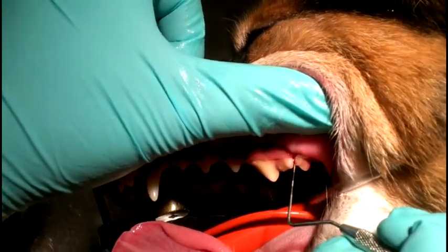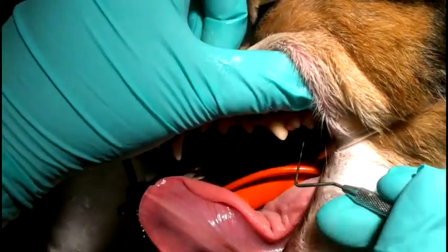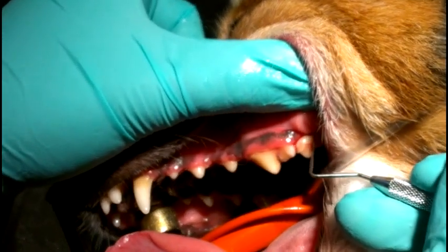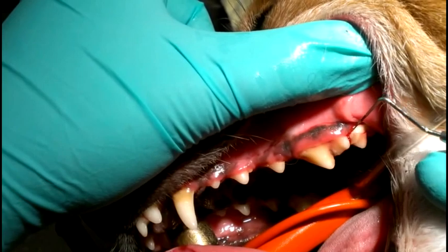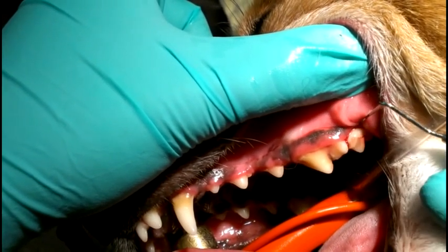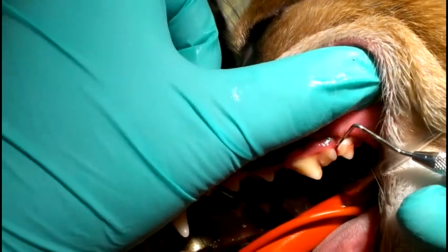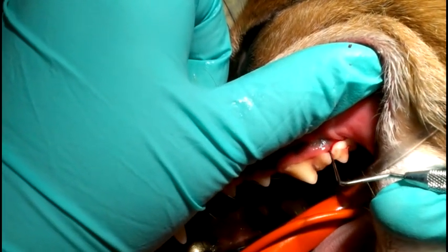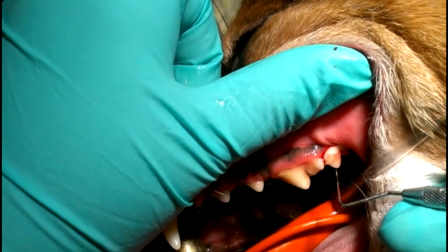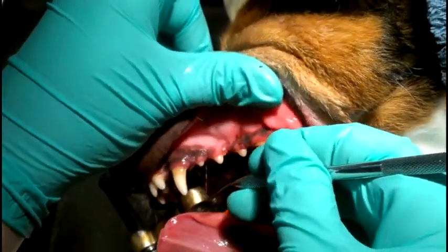Okay, we just flipped Mabel over to start cleaning her teeth on the upper left side. And what I noticed when I probed is this first upper molar has a lot of gingival recession. You can see how the probe kind of goes up in there between the roots. So what we're going to do next is take an x-ray of that tooth to see if it's abscessed or loose or if it's a tooth that she may need to have extracted today. All the other teeth on this side, though, look pretty good.